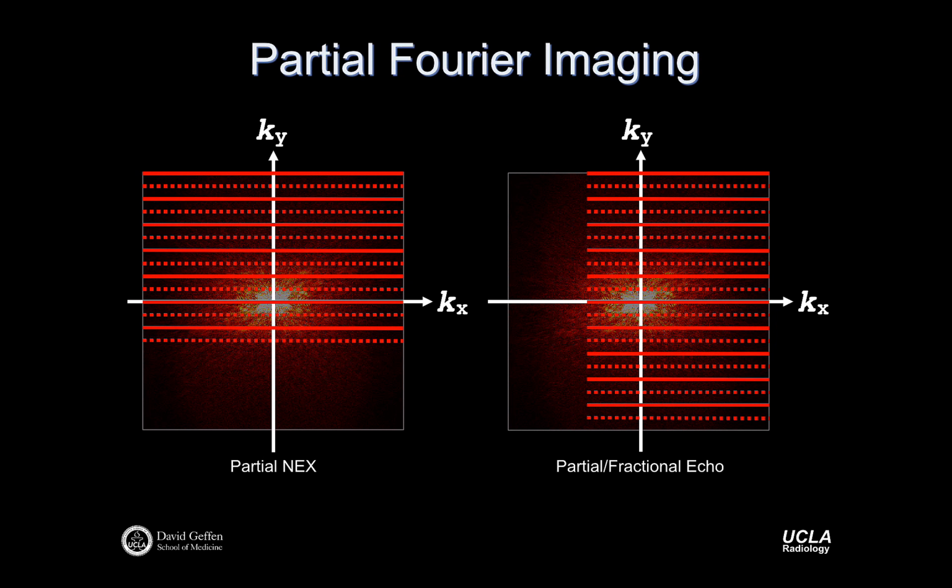What do I have to do differently? This area in the negative. Yep. And so maybe this first gradient here, I could draw it different ways, but if that first gradient is shorter, right, so maybe it's A by 2, then I'll only go out half as far, and then I'll form my echo again at A by 2, but if I want to get all the way across K-space, I still have A. So the K-space trajectory here would be to go out a distance A over 2, and then turn around and read out this way, a distance A over 2, and then distance A.